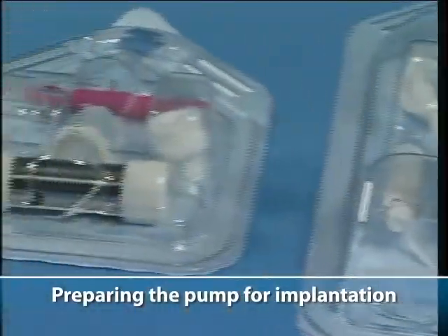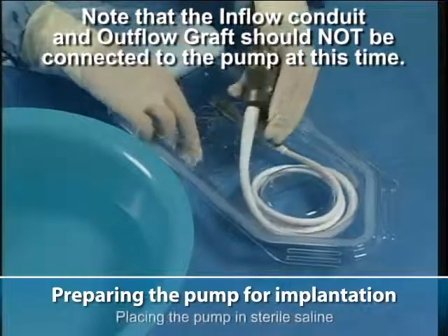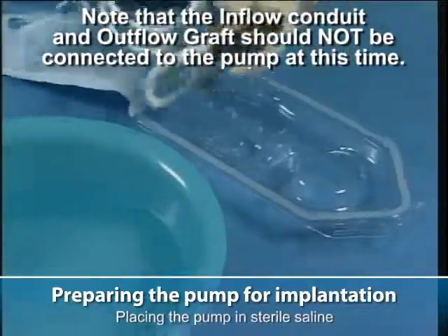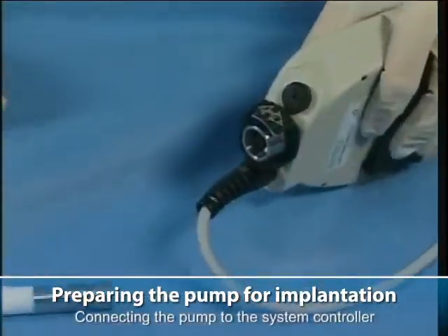Preparing the pump for implantation. Placing the pump in sterile saline. Connecting the pump to the system controller.